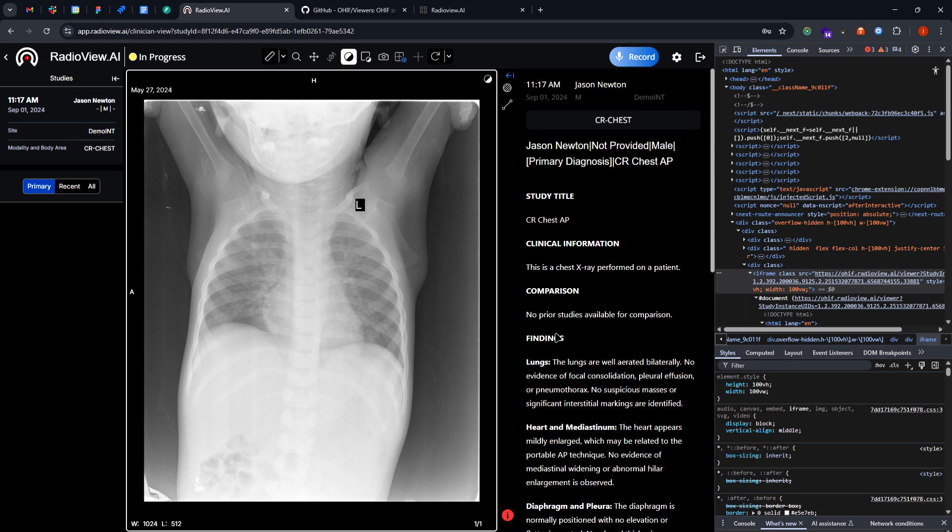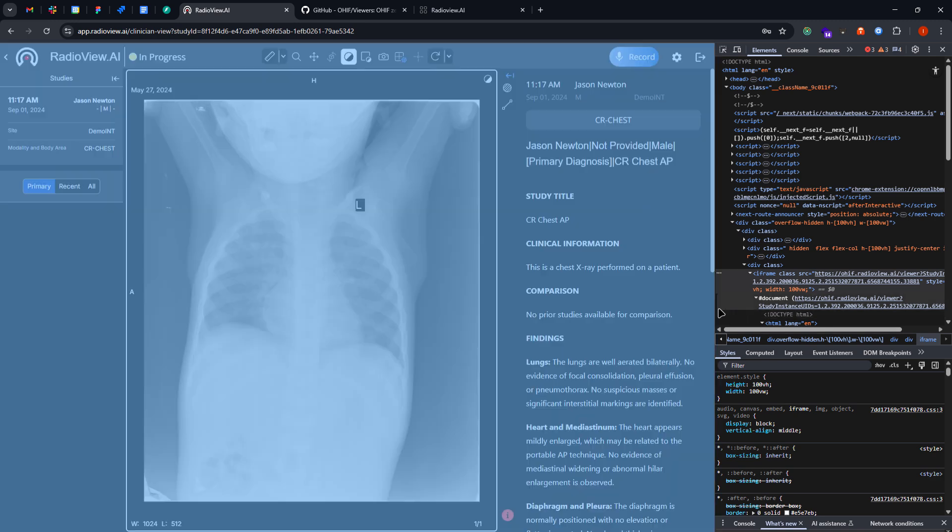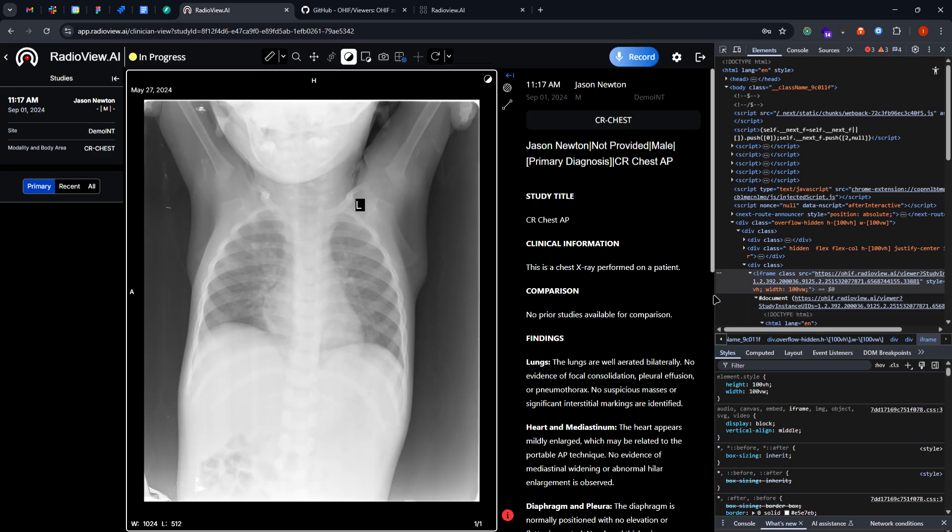And if you don't know how to set up your ORTHANC server with the DICOM viewer, you can leave comments below. I can also follow up on that video giving you the right information.